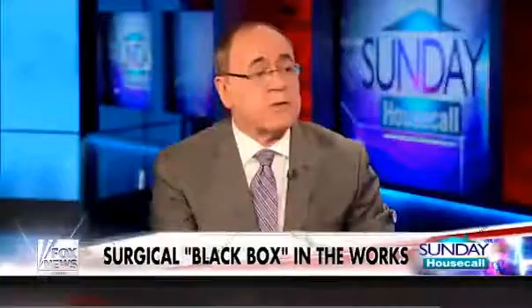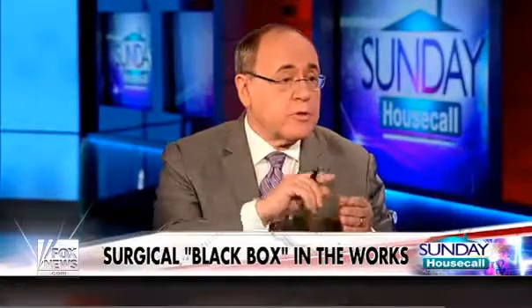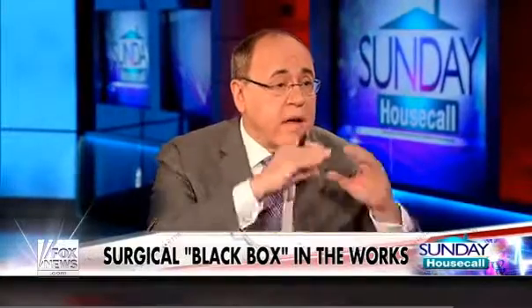I agree, though, that the number one purpose of this is teaching to learn from mistakes. And by the way, somebody who comes out post-op, you may not know why something goes wrong. If you can go back, there's something called arachnoiditis, where somebody accidentally punctures the lining of the spine and you get some nerve problems. If we could go back to the operation, we could see exactly where that happens. So there's a great advantage in terms of learning.